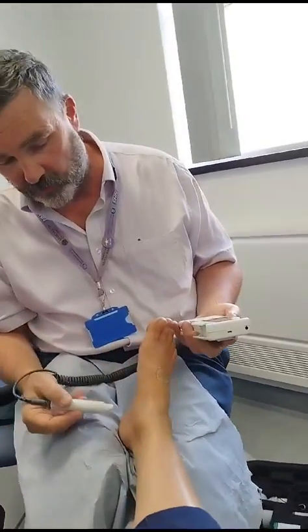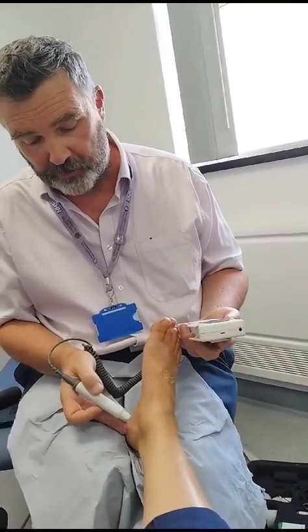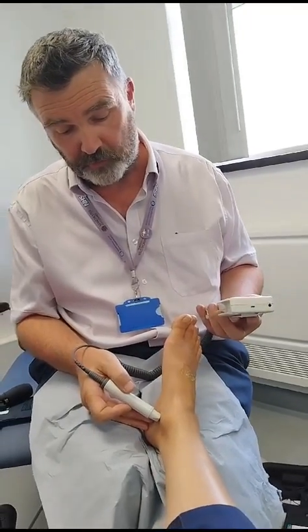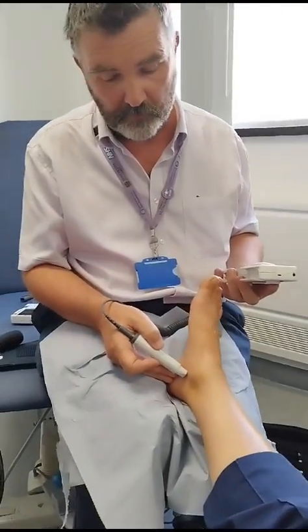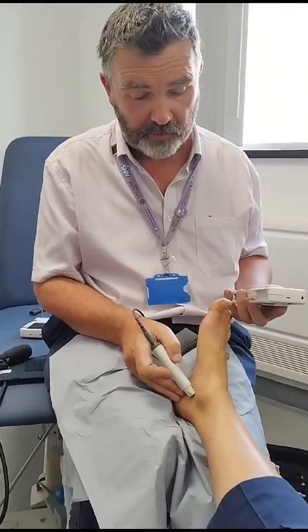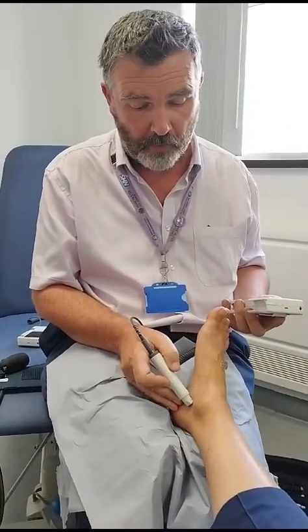Then I'll try the same thing on the posterior tibial artery, anchoring to the heel first, sliding from left to right across where the artery may be, angling the probe up the leg, again considering whether it's multiphasic or monophasic.